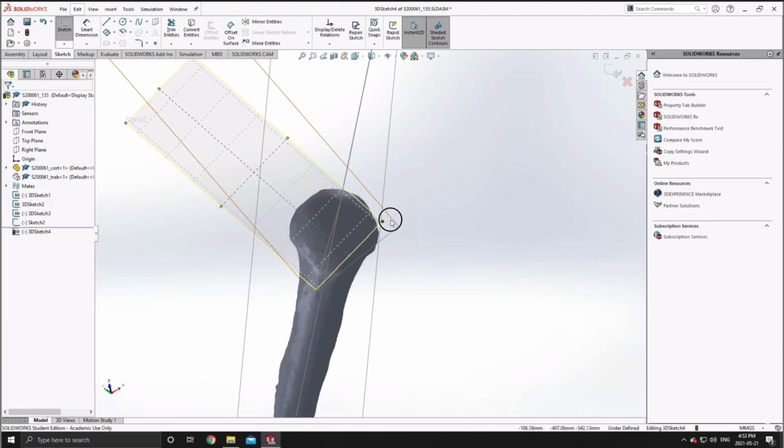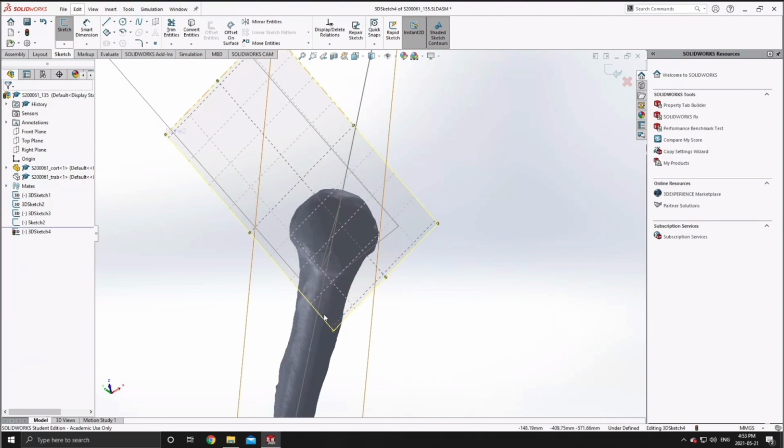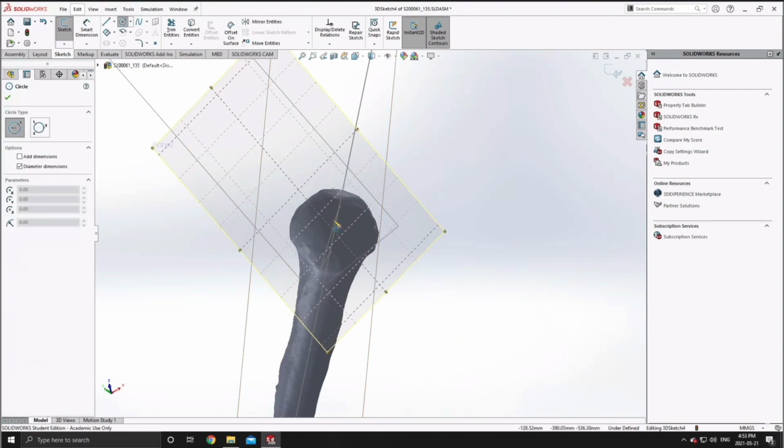Our secondary relationship is, of course, the lateralization of our cut, and that we defined earlier as intersecting with the inferior ridge of the humeral head. And of course, the tertiary positioning relationship is the angle of retroversion that we isolated earlier. So our new plane must be orthogonal to the initial plane that we used for calculating our neck shaft angle.